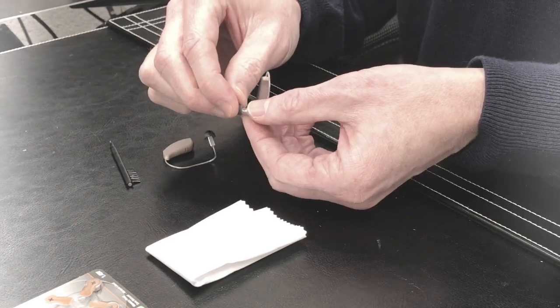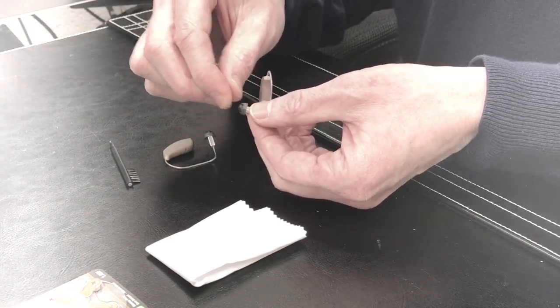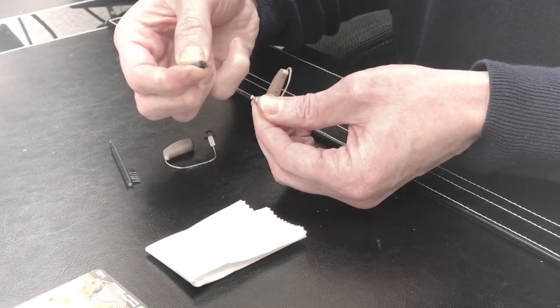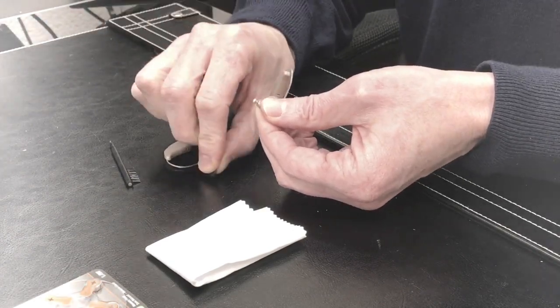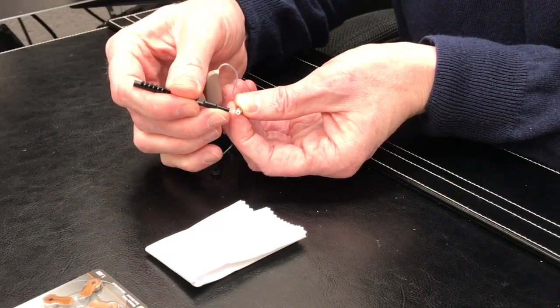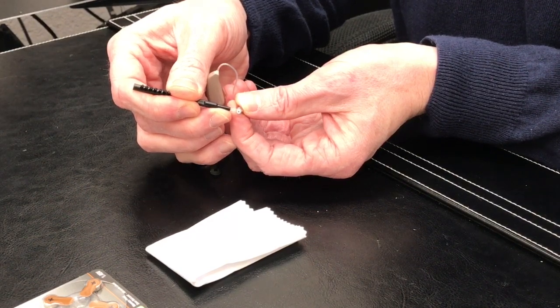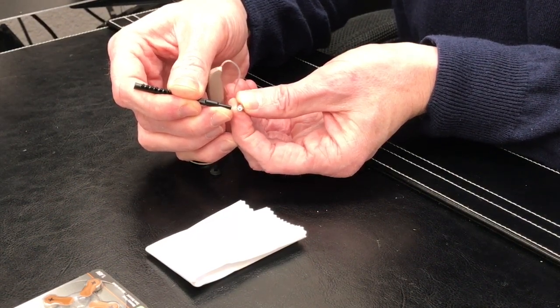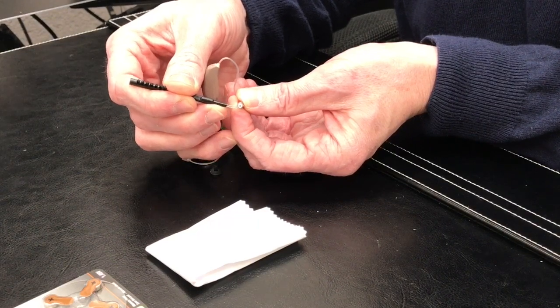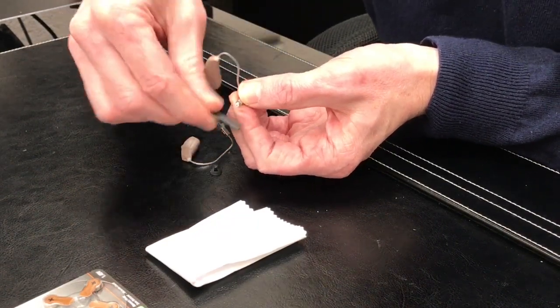Periodically, you want to actually remove this tip or dome. Just grab it and pull. It'll come right off. Underneath, you've got what we call a wax guard, which is a small insert that protects the speaker by collecting wax and preventing it from getting further back into the component. Again, that can be brushed out.